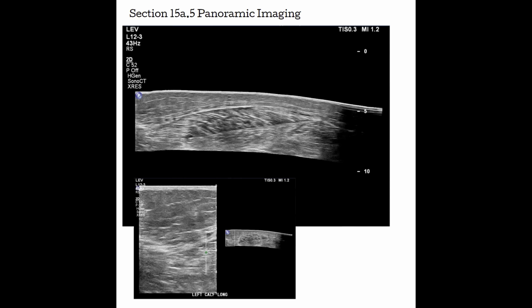And as they slide the transducer down the body, the machine is going to be acquiring scan line information. And what it's looking for is scan lines that match up. And once it finds a couple that match up, it's going to recognize that those are overlap areas. Then it's going to start adding to the picture along the direction that you're traveling in. So essentially what it's really doing is just taking a bunch of frames and then gluing them side by side to make a really wide field of view.